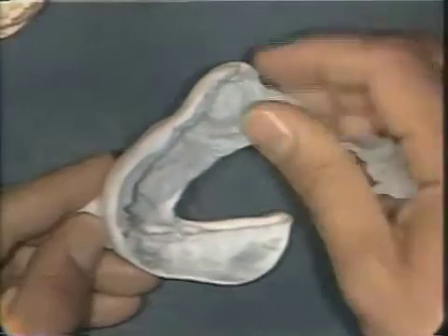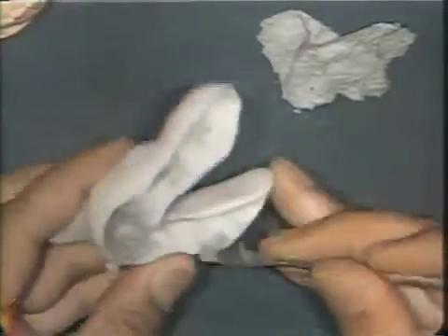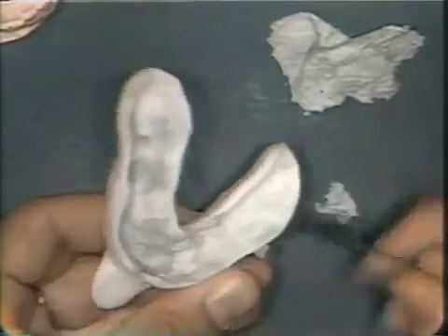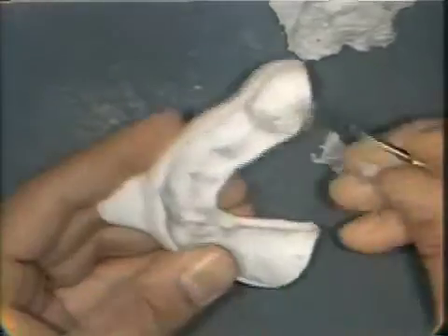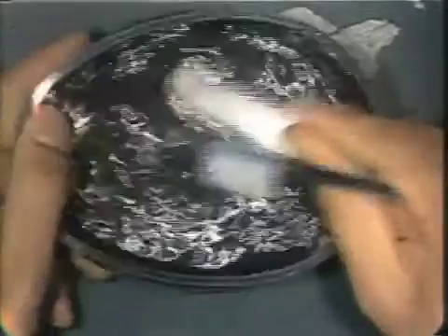After the tray is hardened it is removed from the cast and the asbestos is peeled out from the tray. This is accomplished by hand and by use of a number 7 wax spatula. The residual asbestos is scrubbed out using a toothbrush and water.